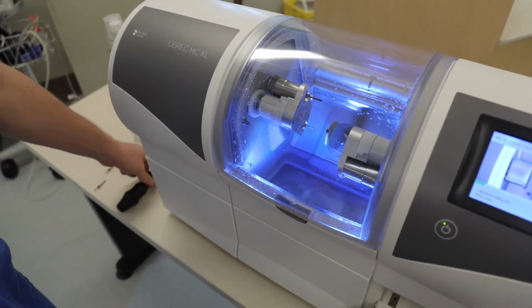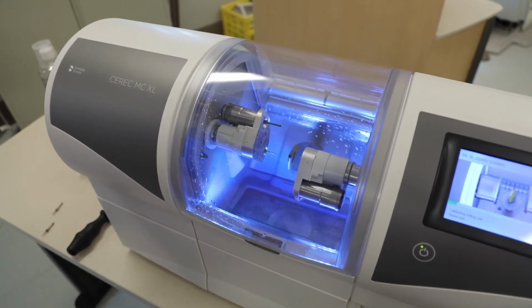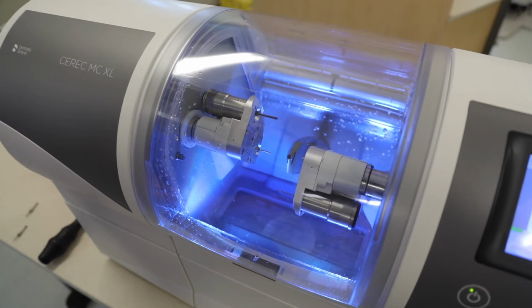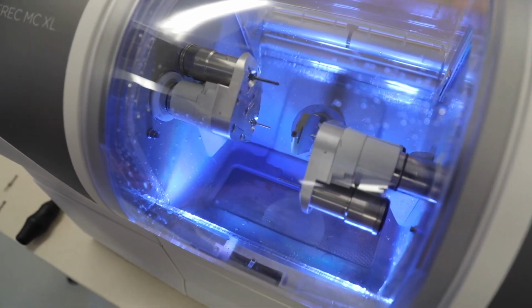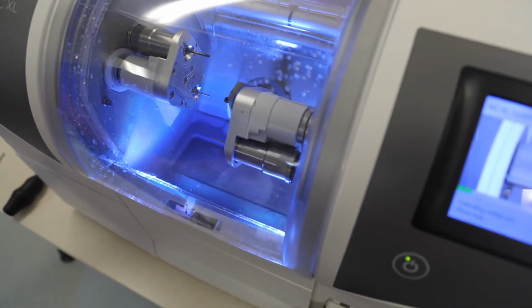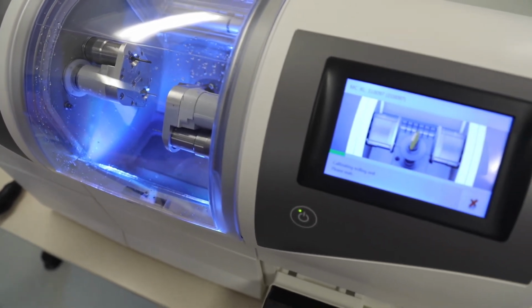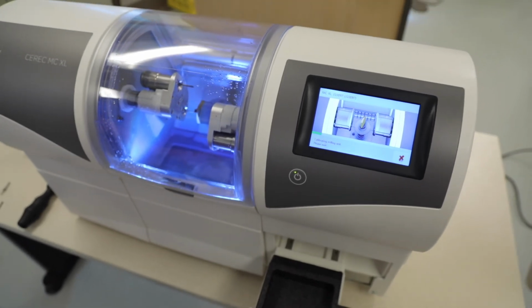So the calibration will take roughly 15 minutes, give or take five minutes. So doing this in between patients might take up time, so you might want to set aside time during the week that you won't be so busy to calibrate. And they'll start measuring the calibration block and plate. Again, this takes several minutes of time, and it's pretty self-sufficient. It just runs and does its thing.